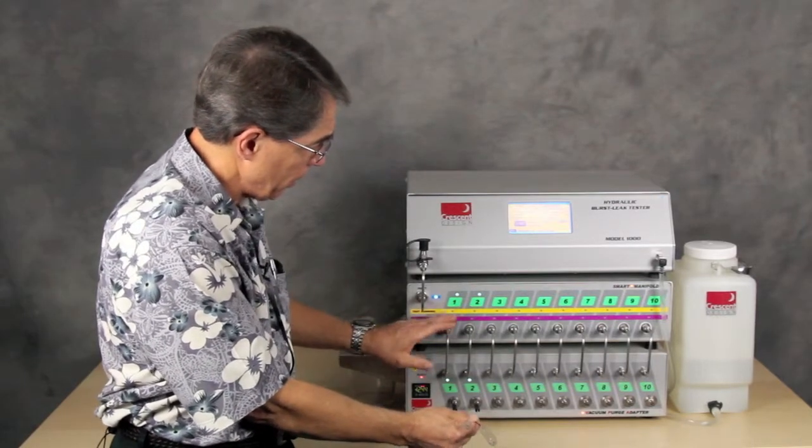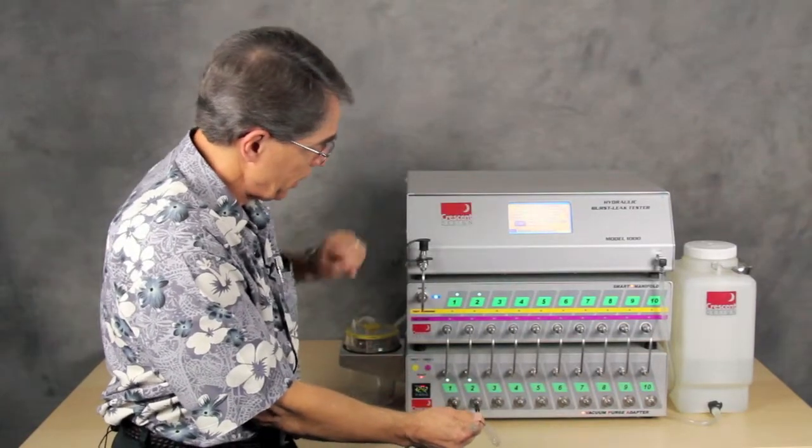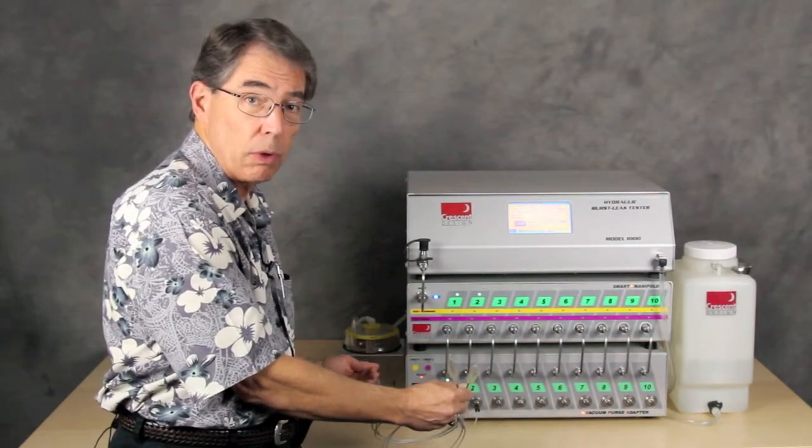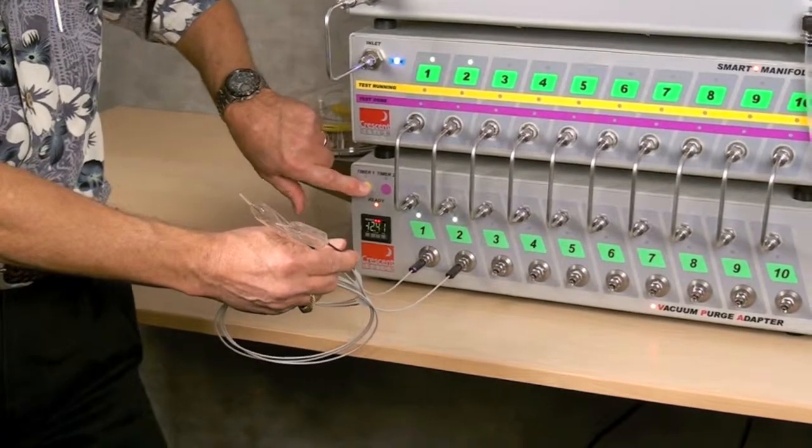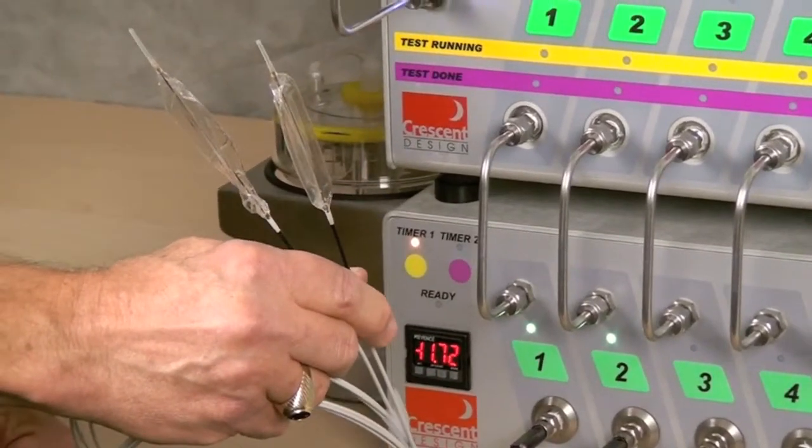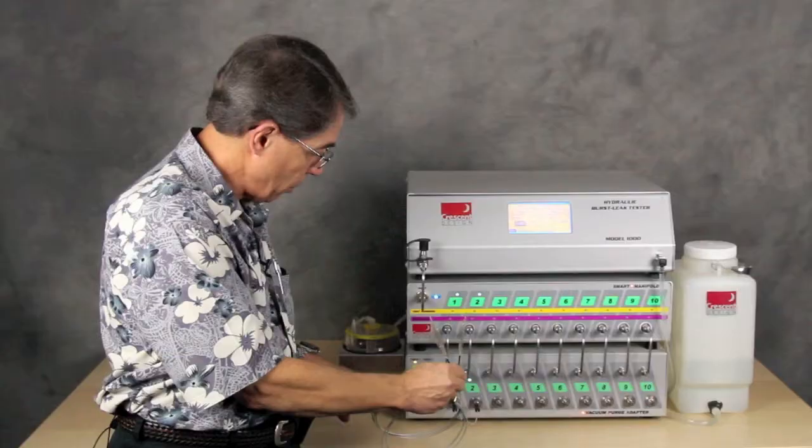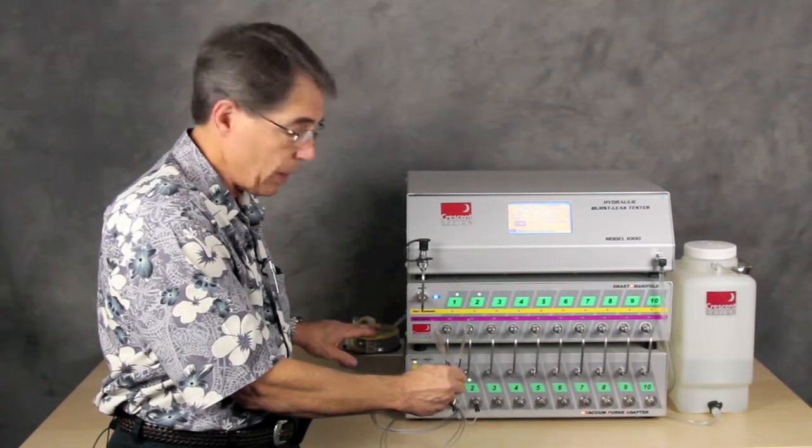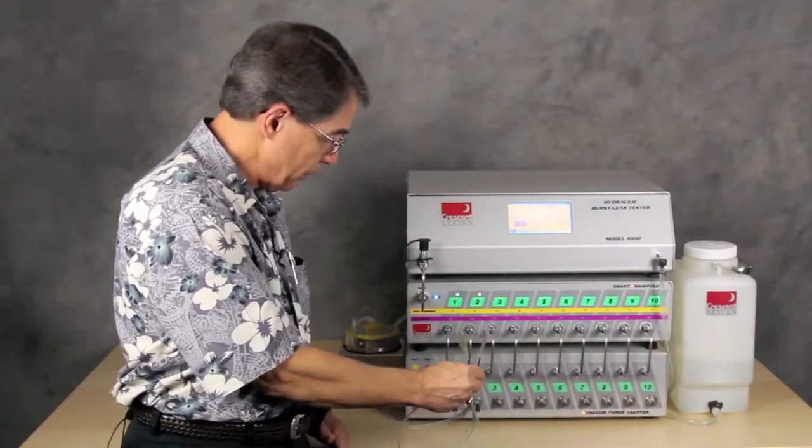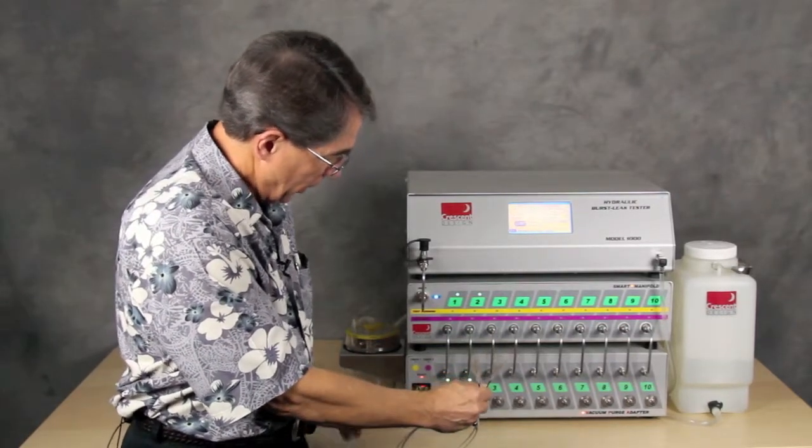So I have everything set up with our smart manifold. I've selected ports one and two on the VPA. And I have a test set up here. So prior to the test, we need to prepare the catheters. That is to say remove all of the air. So I will hit timer one. And you can see that right away the catheters, the balloons are evacuated. And the pump is cycled on as it draws the air out into the vacuum container mounted on the side of the VPA. And we'll go ahead and let the vacuum pump cycle off so it's not quite as distracting. And it's done.